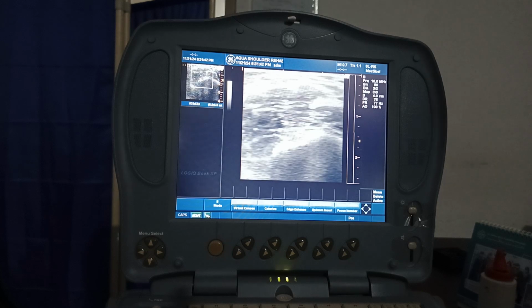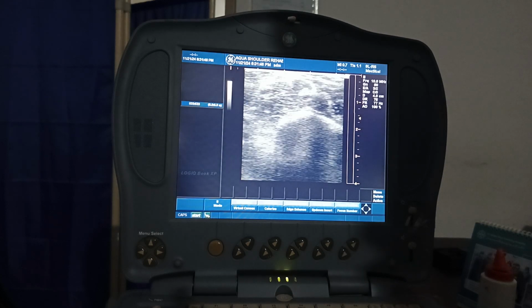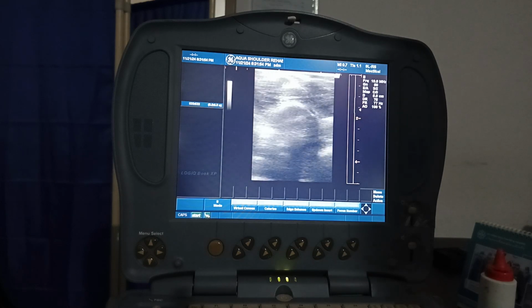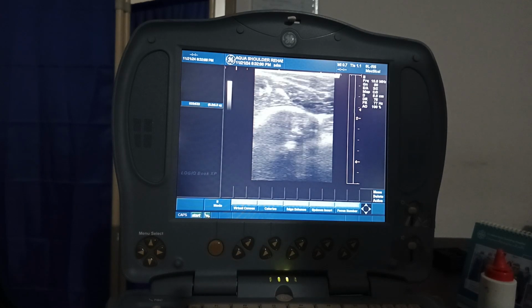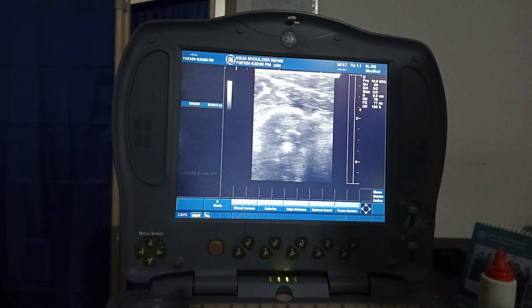We will try to see whether there is any. Let's clear the zoom. Sorry, I have to clear the zoom. Okay, let's lift this up. Do you have blood coming? Really? Our model is too thin.